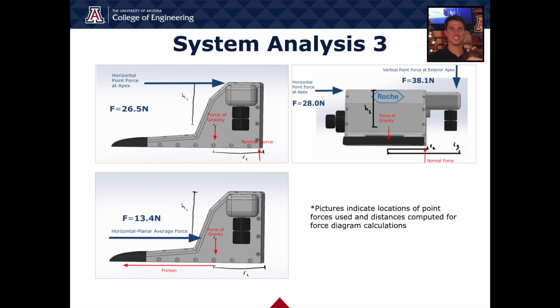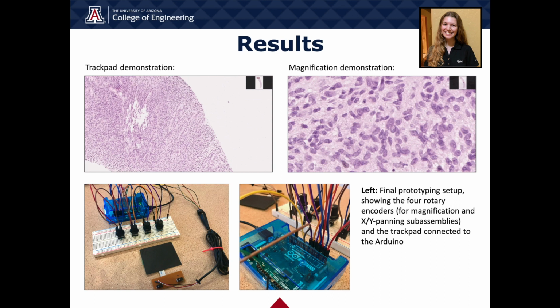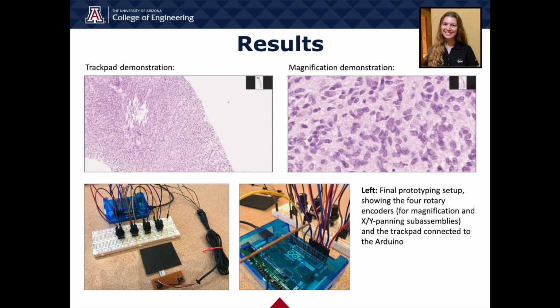Our next presenter will be Madeline, and she'll be talking about our software design. Hello, my name is Madeline Armstrong, and I will be discussing the software and electrical setup of the PUI.